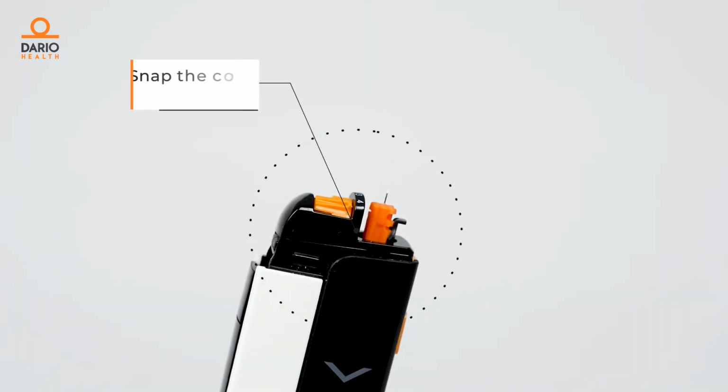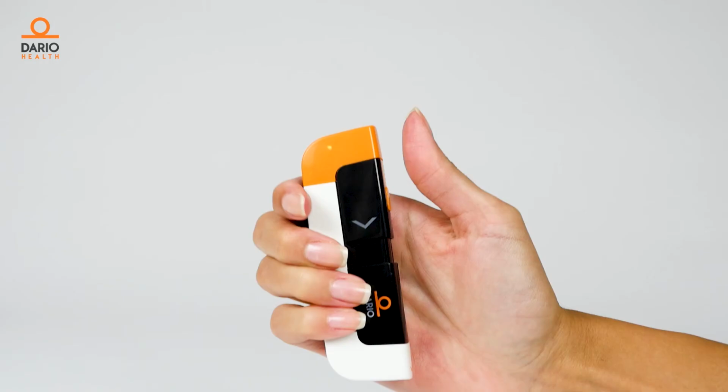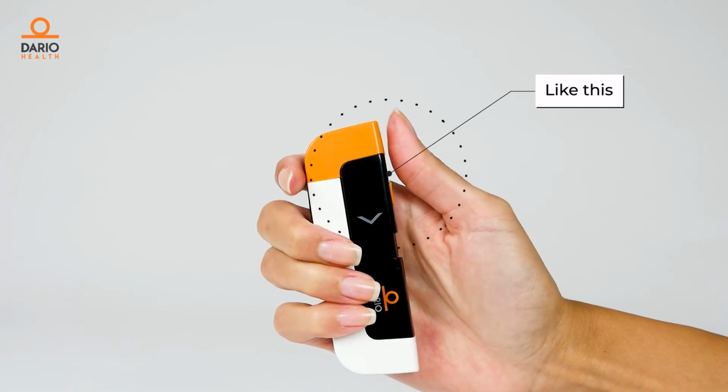Once you've inserted a new lancet, snap the lancet device cover back on the Dario housing. To remove the lancet, make sure the lancet is released and not loaded like this.